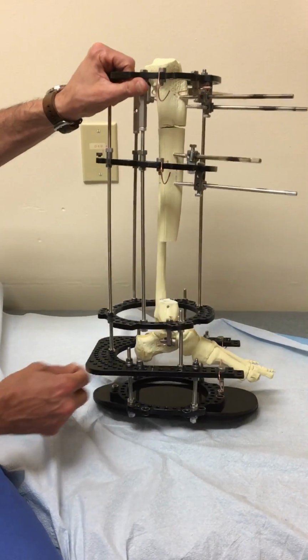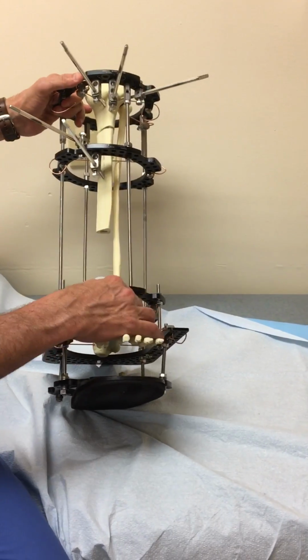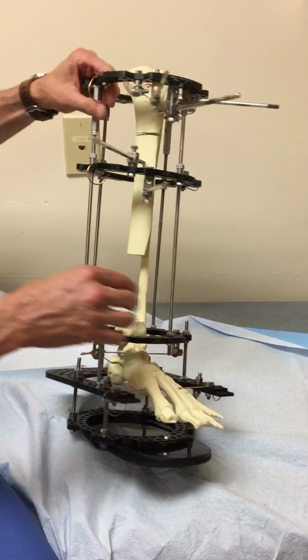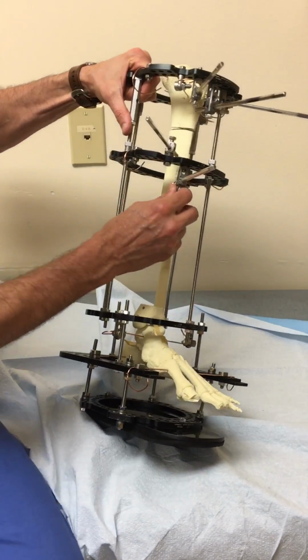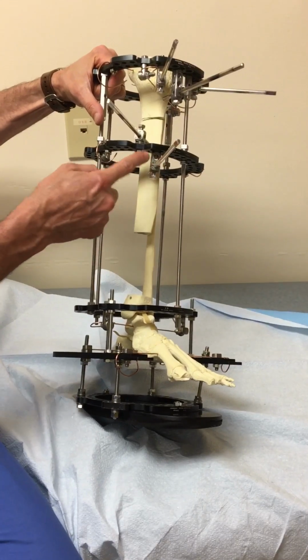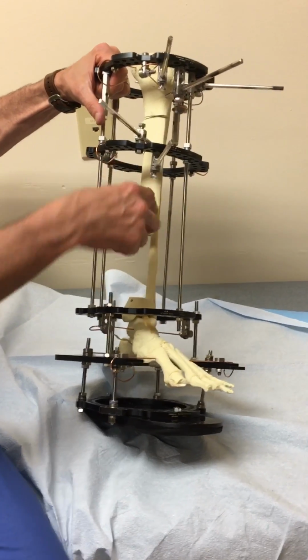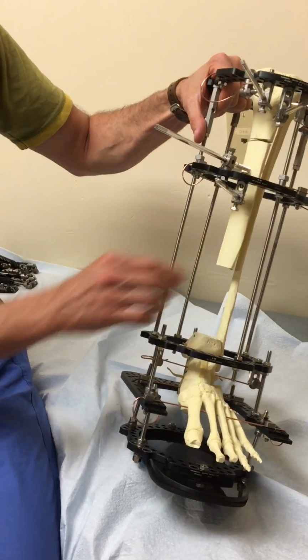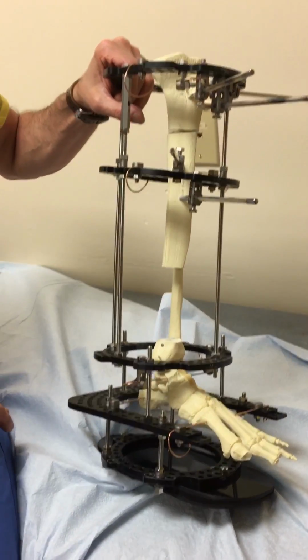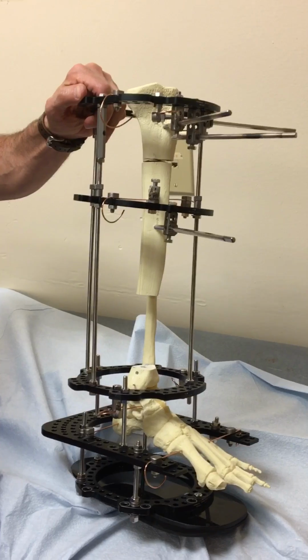Now, the way we've built this, we've built it generous so there's plenty of length. So if you find that some of these rods are sticking down too far and hitting the foot, you can just cut them off. And then the other thing that I would change is, remember the angled half pin? Put an angled half pin, instead of just going 2 holes off of here, put an angled half pin down this way, and that'll get better support on the moving fragment. And I've built this so that no fixation is closer than 3 centimeters to the osteotomy, okay? So make sure you stay 3 centimeters away from the osteotomy.